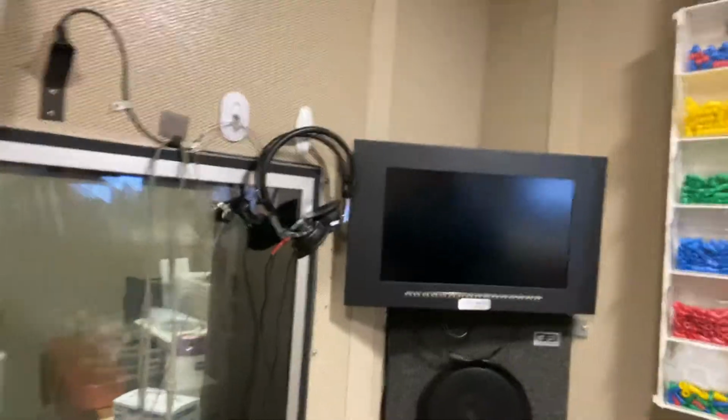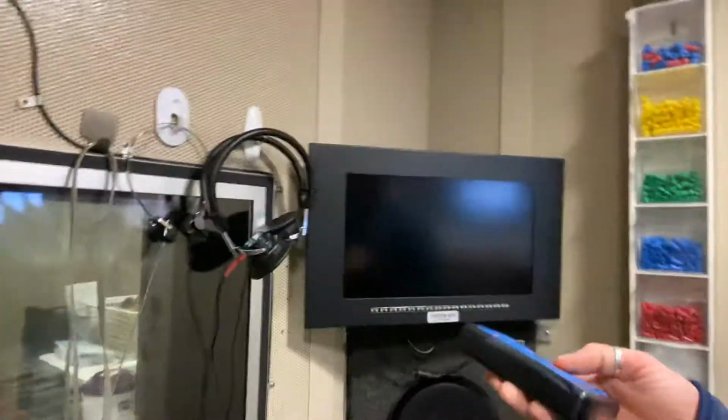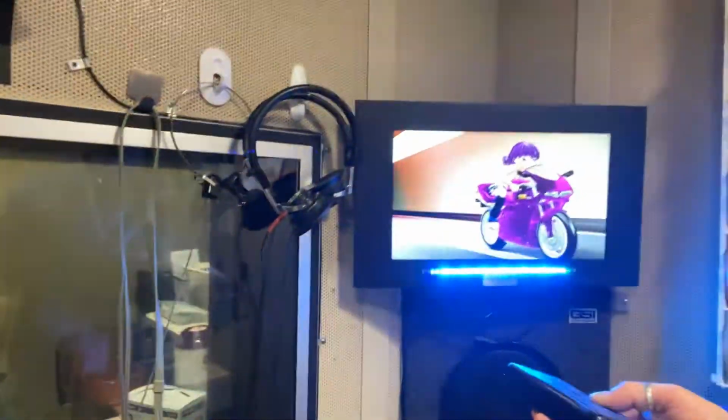What is that? Hello, how are you, baby, bye-bye. What is it? What happened? The baby's looking around. Then I will press the button on the audiometer, say, hello, baby, and if the baby turns and looks, then I will reward him or her with the visual stimulus, okay?